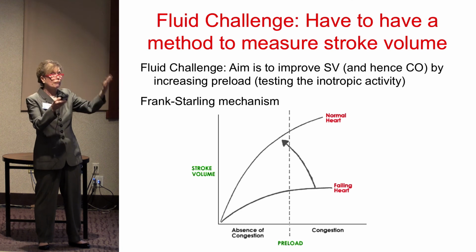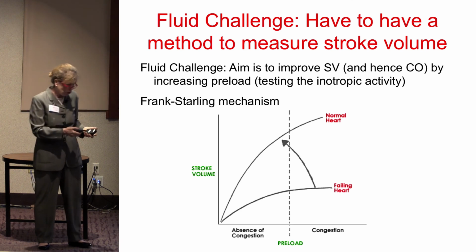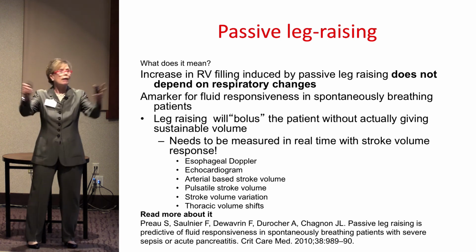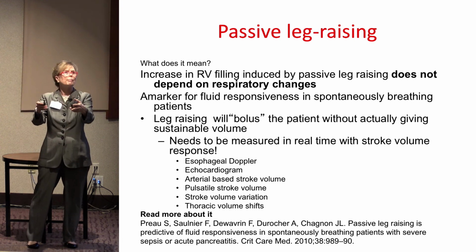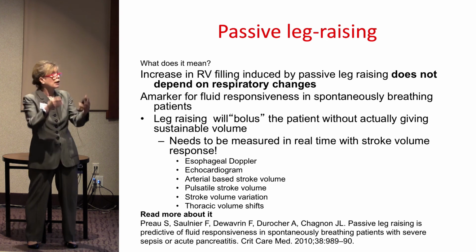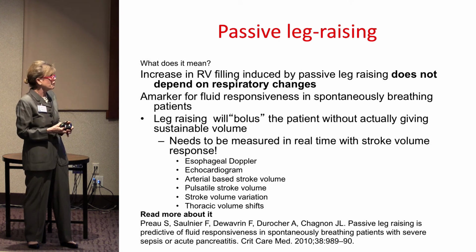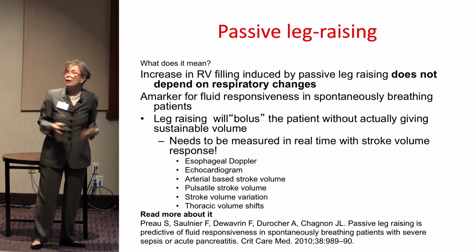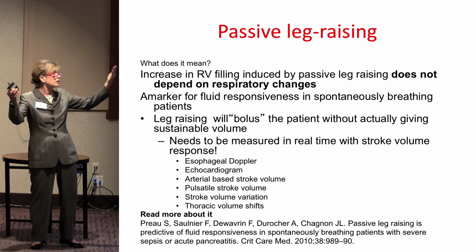And not really perfusion, more importantly, LV ejection. Okay, so one of the things we talk a lot about, and of wonderful methodologies, and everybody should make sure they get some time to look at all of our methodologies that are available here today for you to evaluate, talking about giving the patient his own fluid bolus by lifting his legs.